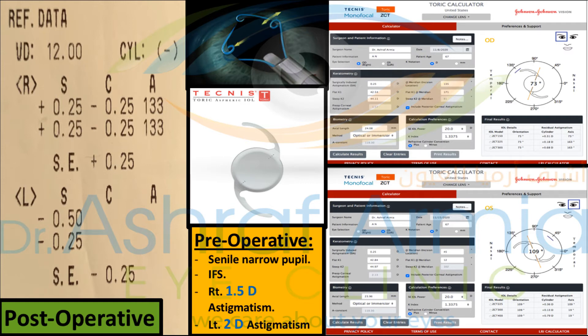We achieved this because we did everything correctly for this patient: we used the Malyugin ring to dilate the pupil, we used the best IOL for this patient — the Technist Toric with its four dots for precise alignment within the pupil. Thank you so much.